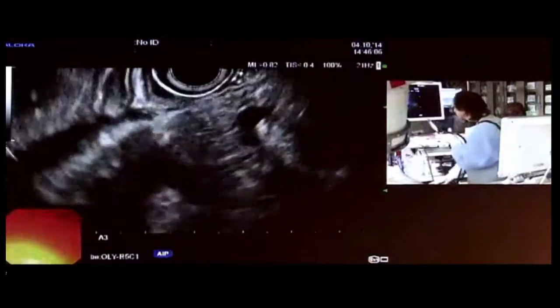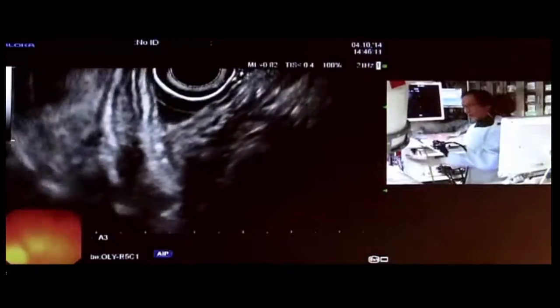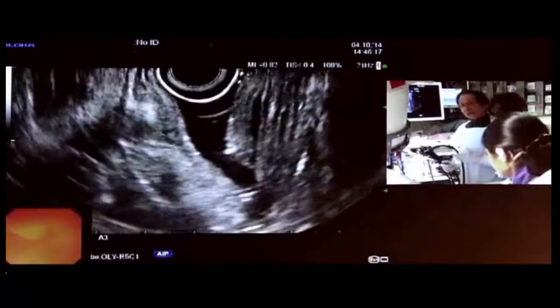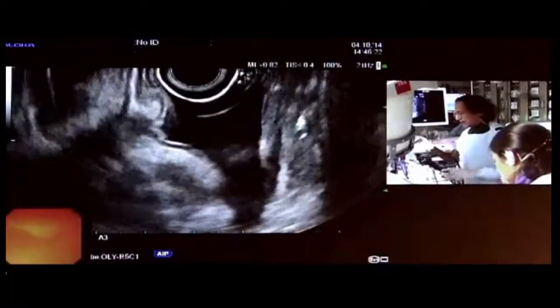out of the sheath. We're going to just take a quick moment to turn her onto her back, and she's tubed, so we don't have to worry about aspiration. Now, if she were not tubed, of course, we would have to be very careful when moving the patient into the supine position.